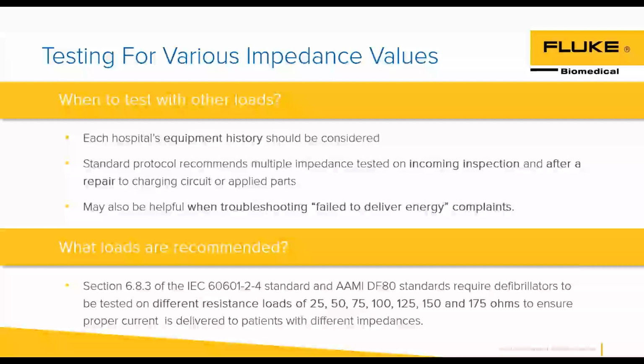Specific times we should definitely be testing at these different values is anytime we're doing an incoming inspection. So anytime I have a brand new defib, I want to make sure that each and everything in that defibrillator is working exactly the way it should. And if you look in the service manuals, this is another challenge. Do you have the right version service manual? I'm here to tell you, I work on some of these defibs and they're on like revision M or R. So A through R have been different revisions.